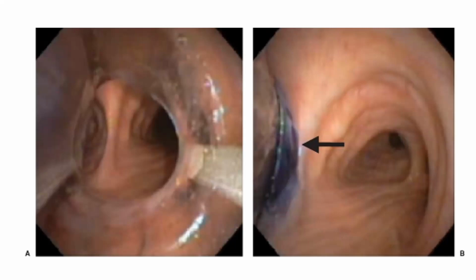So in the left picture, we have to deflate the cuffs, both tracheal and endobronchial, and pull out a bit until you can see a thin blue color rim just outside the left main bronchus. So the right side is the correct positioning. The left side is too deep already. Can you see or not? Yeah.